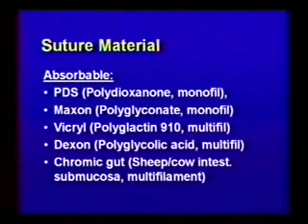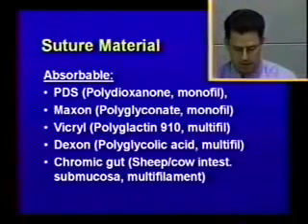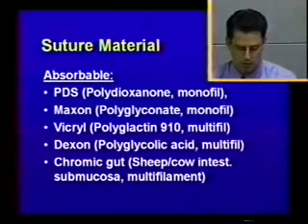To start with, suture material. The absorbable suture materials, PDS or polydioxanone, is a monofilament suture, very similar to Maxon or polyglyconate, which is also a monofilament. Both of these will be present in the wound for up to around 6 months. Vicryl or polyglactin 910 is a multifilament suture. This is going to be absorbed much quicker, within a few weeks.